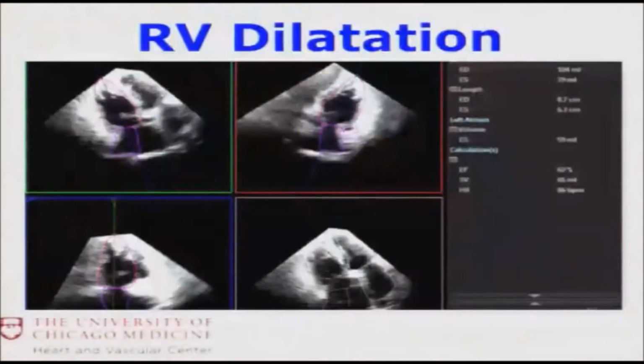This is a typical patient with a right ventricular dilatation. When you try this, the model thinks that the right dilated ventricle is the left ventricle, and makes these calculations erroneously on the right ventricle.